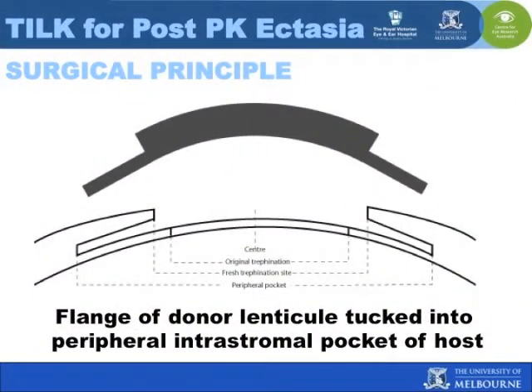Next, a donor tissue will be prepared to match the contour of the host bed. A 9 or 9.5 millimetre trephination of 300 microns in depth will be made in the donor tissue. Lamellar dissection will follow, peripheral to the trephine cut, extending to the limbus circumferentially. The peripheral superficial corneal tissue will be excised.